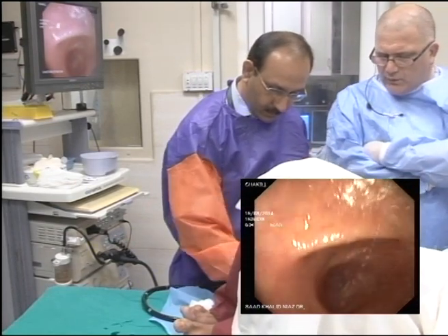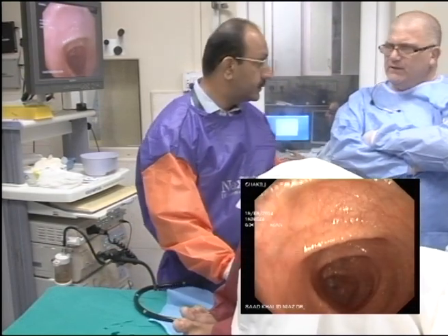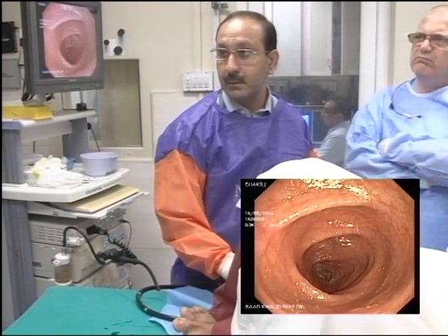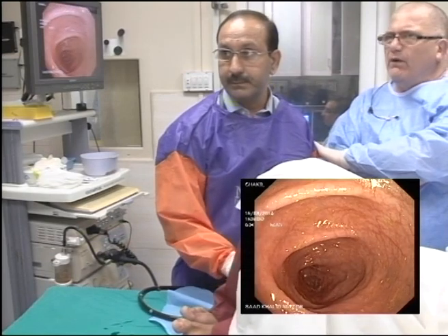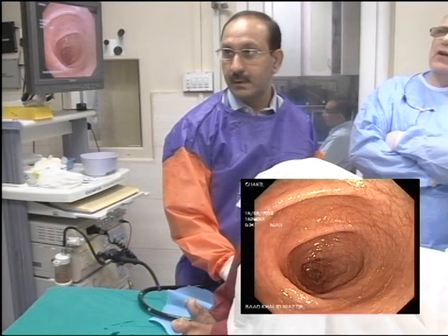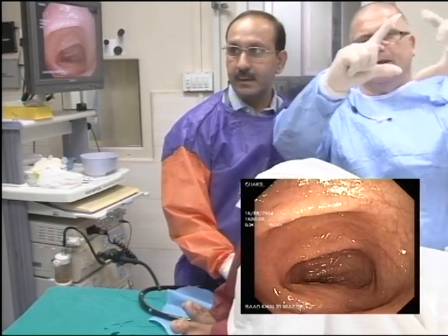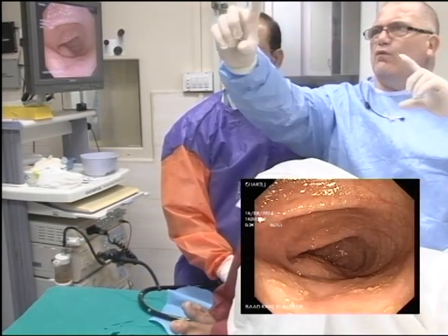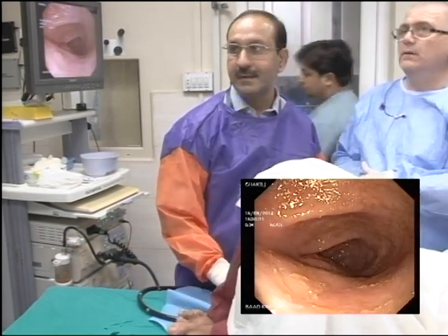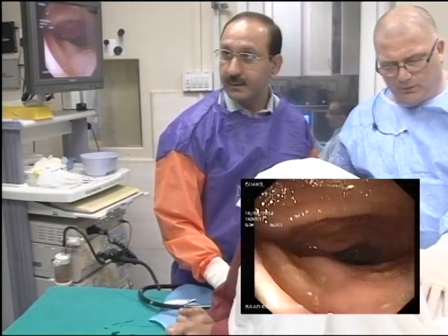Now, my friend, just one sec, sir. How much scope have we got in? 70. How far do we think we're round? I would say transverse colon. Okay, transverse colon to us is more triangular, and this still has rounded edges to it. So I would suggest we were probably still in the descending colon, and that we've probably got a large sigmoid loop somewhere.